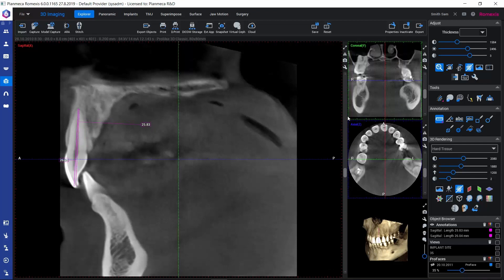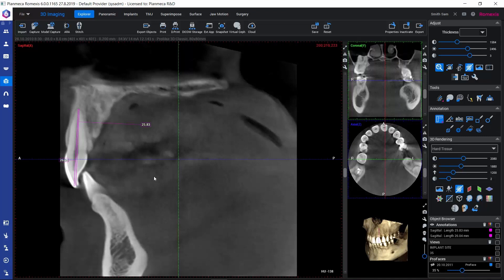If there's the need to measure a polyline, we can click on the small pink corner in the icon and select the polyline measurement option. This allows us to measure several distances and see their total length as one value.